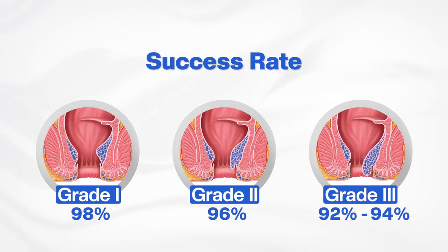We usually do not use this specific method for grade 4 hemorrhoids because when the electrode is carefully placed in a grade 4 bundle, the gases produced significantly increase the volume of the bundle, which is already located outside the anus, and this noticeable enlargement can be quite concerning and uncomfortable for the patient. Additionally, sometimes the entire process can be irritating and bothersome. As a result, we use this method for grades 1, 2, and 3, where it is very effective.